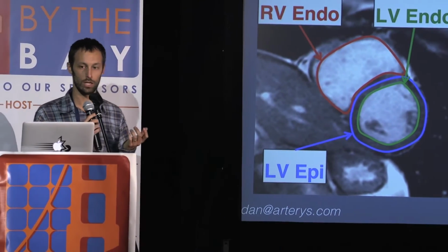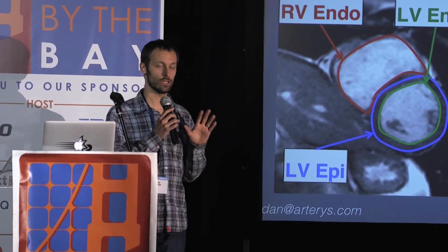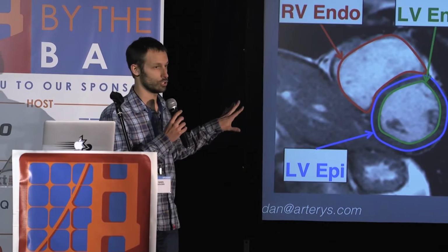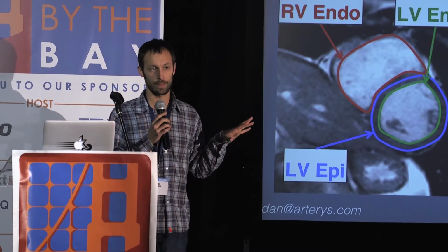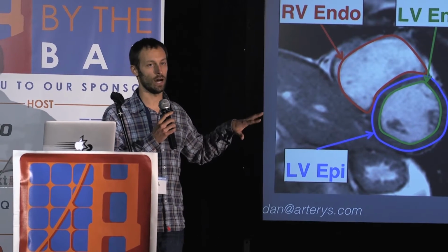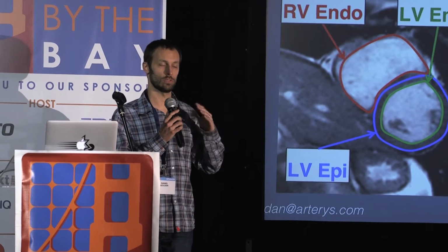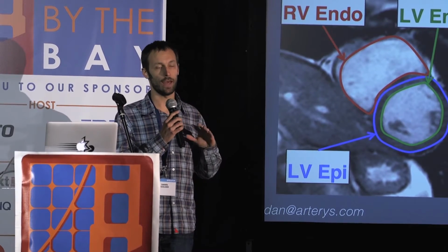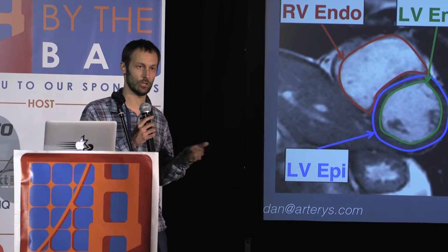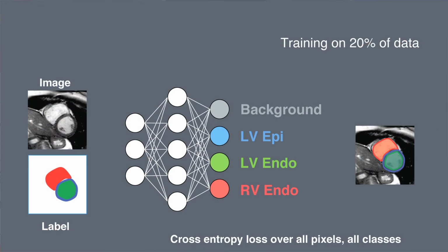So this poses a problem if you want to use a very simplistic segmentation neural network architecture, because most images do not have all the labels you care about. And we want to avoid the onerous process of making different models for each of the different labels, because all those models would take 3 times as long to train, and they would have a lot of information that could potentially be shared but wouldn't be. We wouldn't be exploiting the similarity in these problems.